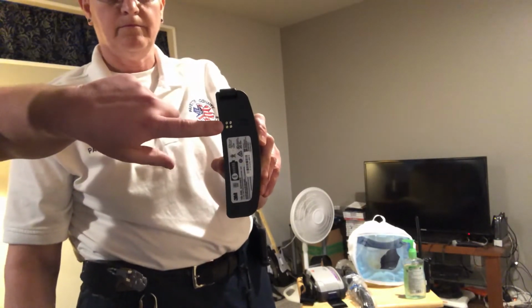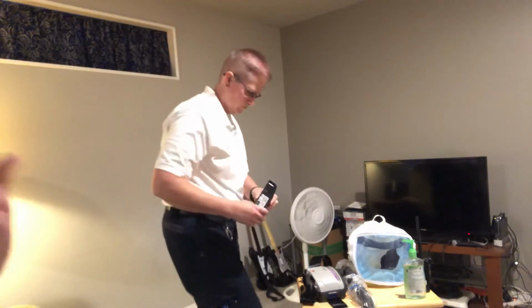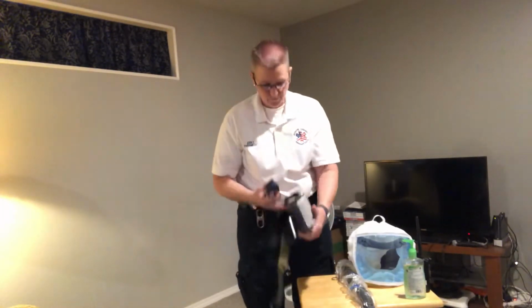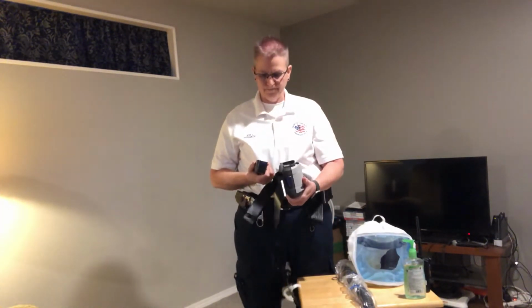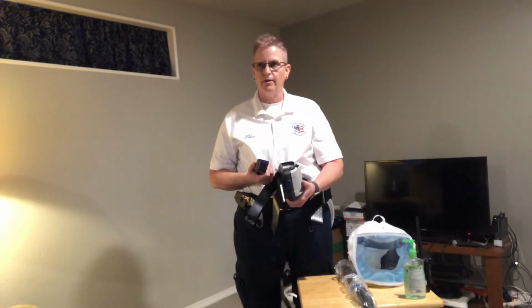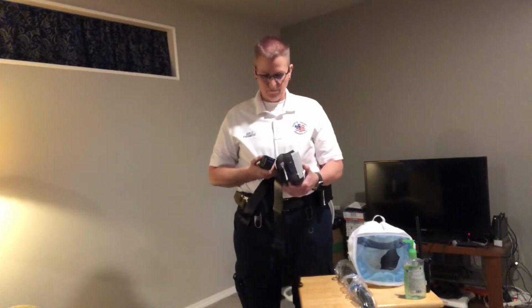After you're done with everything and you're sanitizing, it is obviously very smart to wipe down the battery. Do not wipe the contacts. We've had batteries completely cease functioning altogether just from a brief exposure to any type of alcohol wipe or anything. Don't wipe the contacts. They're not cheap. Please don't. Wipe around them, do whatever you need to do.